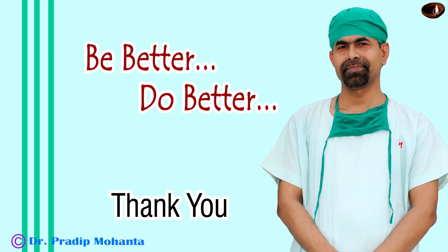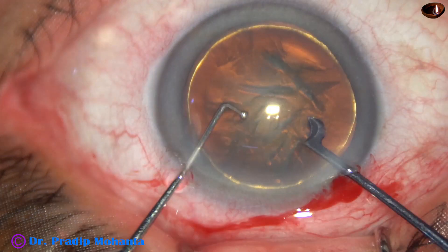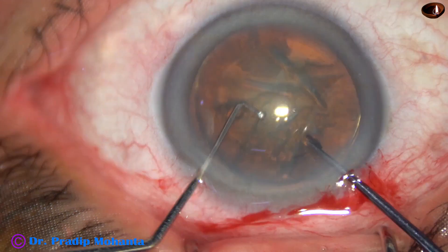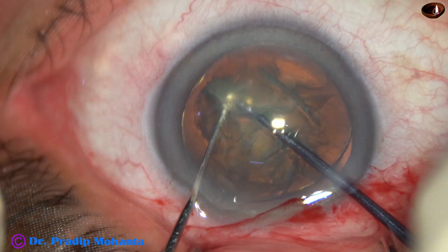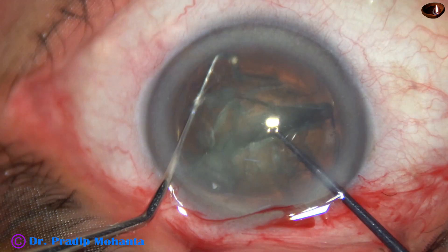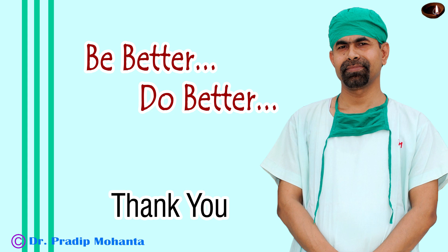Thank you very much for your attention. This video will help you in developing your surgical skills — please learn all techniques. This pre-chopper will definitely help you in some cases. I have no financial interest, but I respect Dr. Sohail for inventing such a beautiful thing. I tried pre-chopping with the Akahoshi pre-chopper but was not successful; this pre-chopper is very easy to use. The length of the pre-chopper is 1.75 millimeter and it is not going to touch the posterior capsule. Please try new ways of managing surgery.